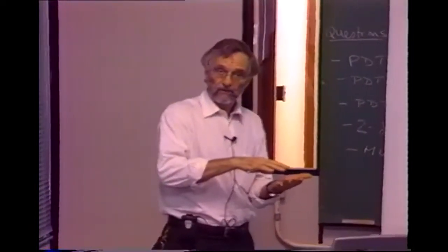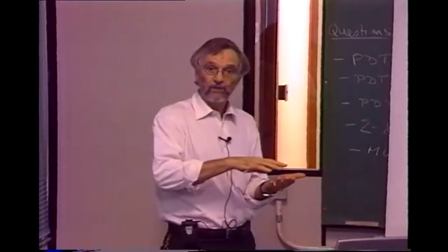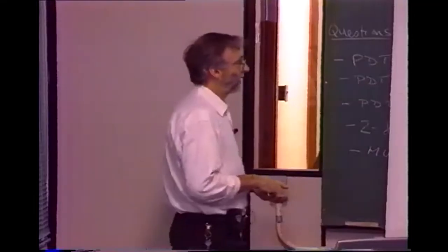LEDs also started to appear in the mid-1990s. This just shows various examples. This is a large array developed to actually do PDT of bags of blood for blood purging to kill HIV virus and also hepatitis B virus. And a number of services, for instance, New York for a number of years used PDT for purging of blood in the blood supply. And I think it's France, in some areas of France, they still use this.